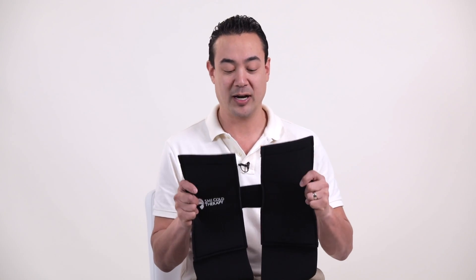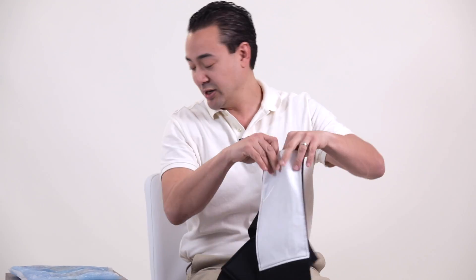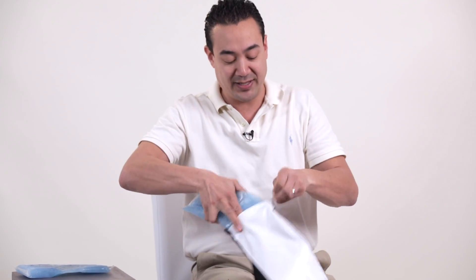This is a guide on how to self-apply the SMI cold compression foot and ankle wrap. We have two gel bags we're going to place into both of the slots here.